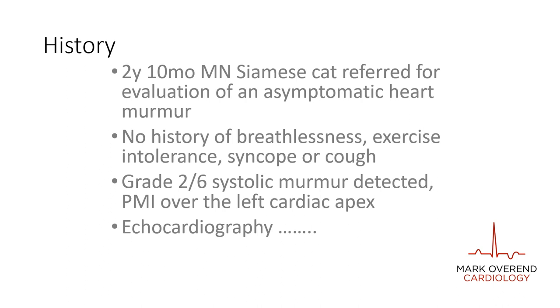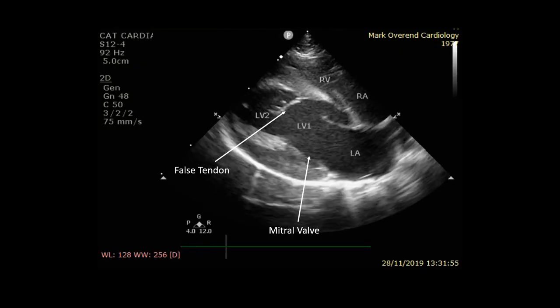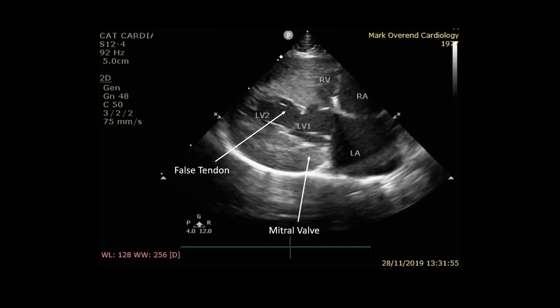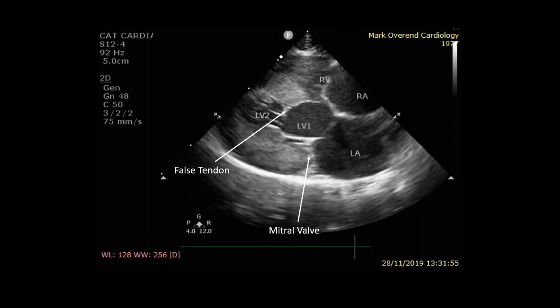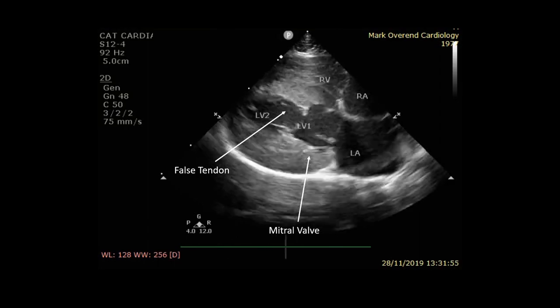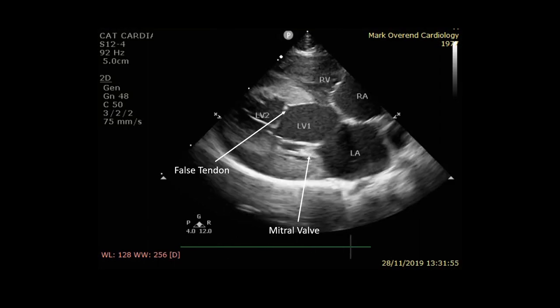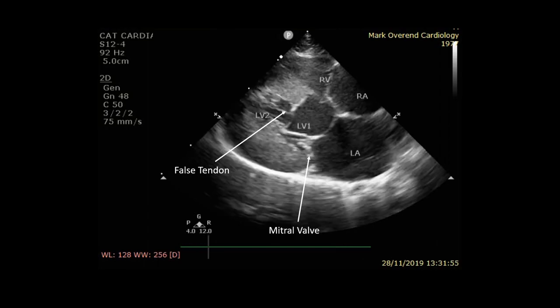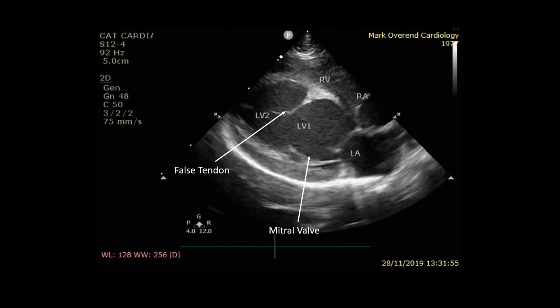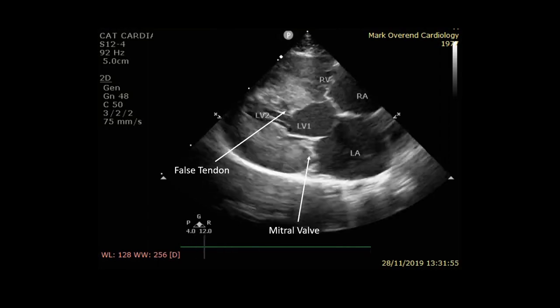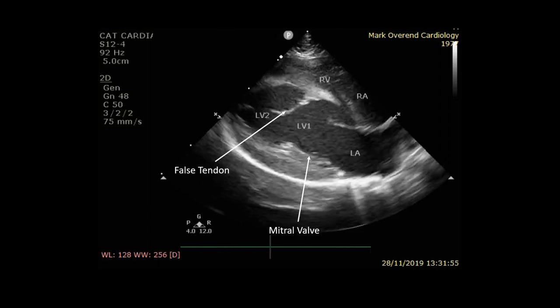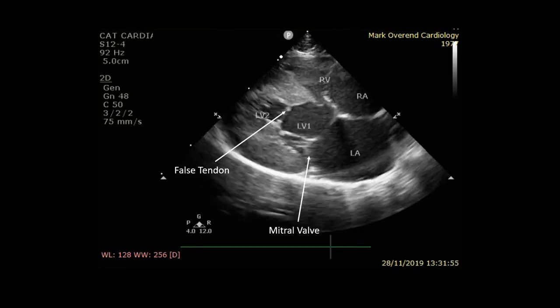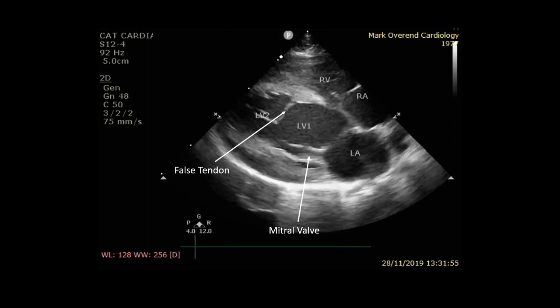Here's the right parasternal long axis view with labels showing the left atrium and the left ventricle separated by the mitral valve. What you can also see is a false tendon which crosses the mid portion of the left ventricle, separating this into what I've labelled as LV1 and LV2.